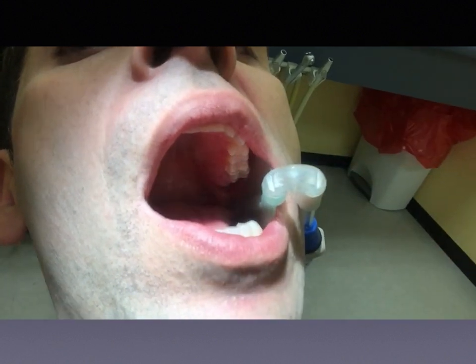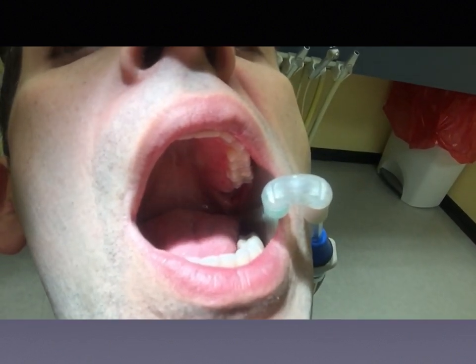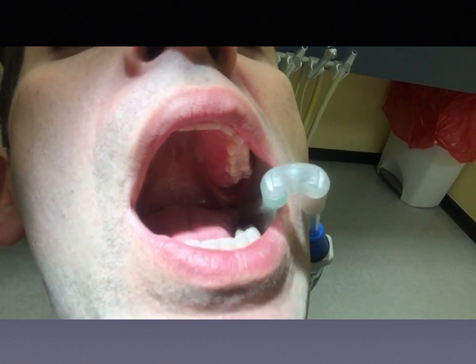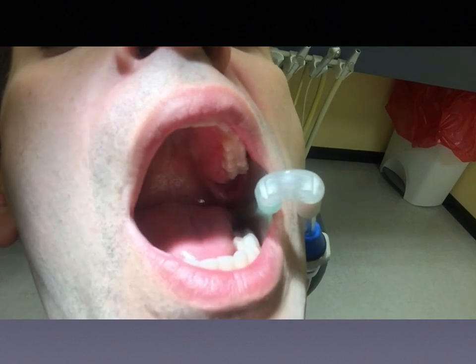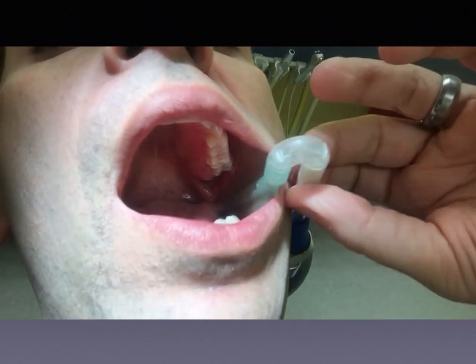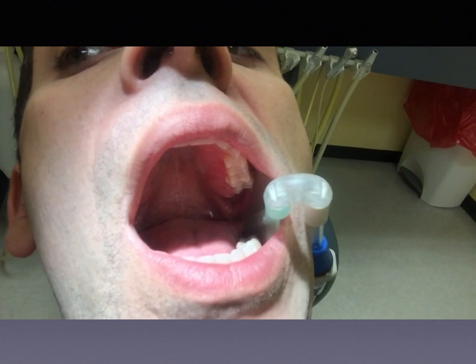It goes in pretty easily, but you can see I'm getting a little bit of tissue suck on my tongue. In my case, punching that second hole isn't really going to help. I also find that the curved part of the plastic tubing jets out of the mouth a little bit and gets in the way.